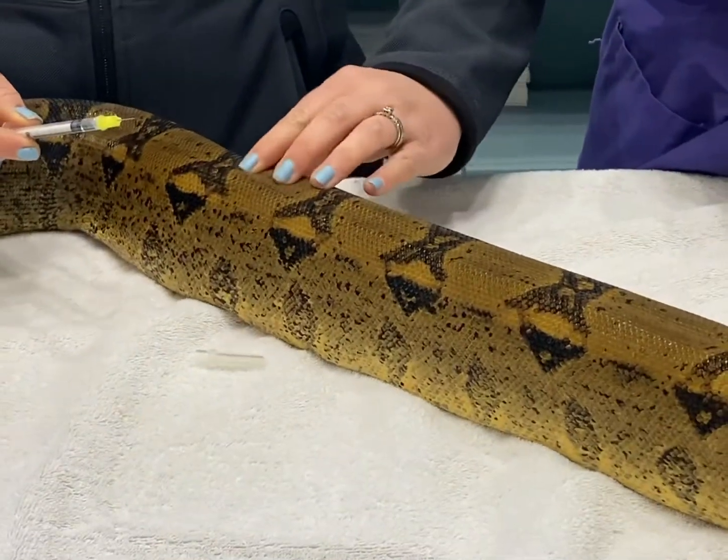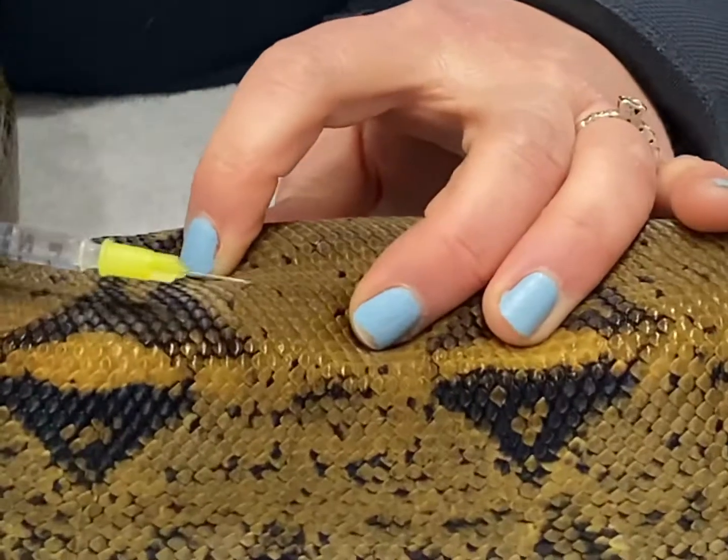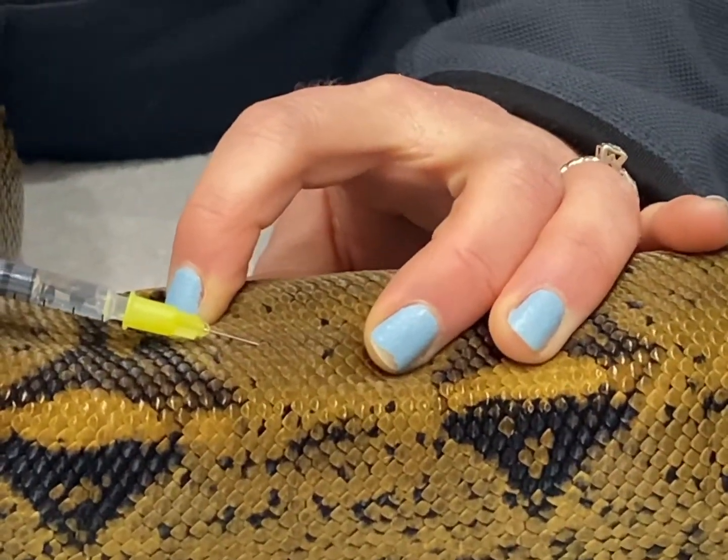Again, you find your spine and then put your fingers on either side. You want to go underneath one of the scales at almost a 30 degree angle and slide in.